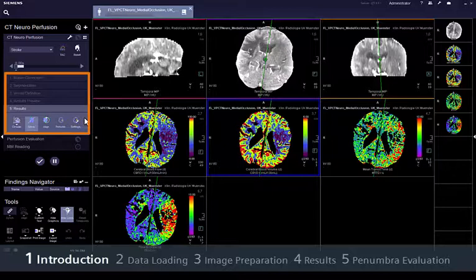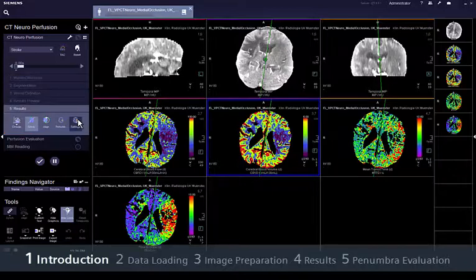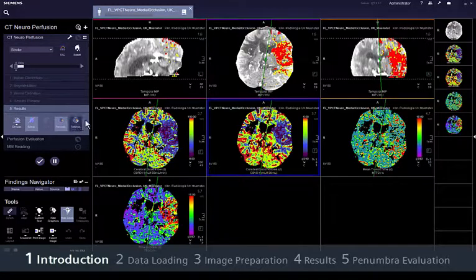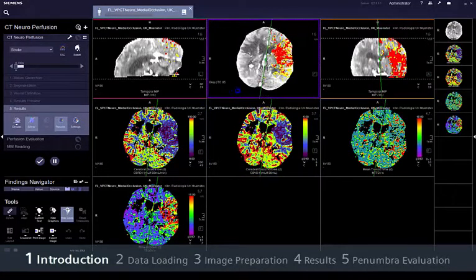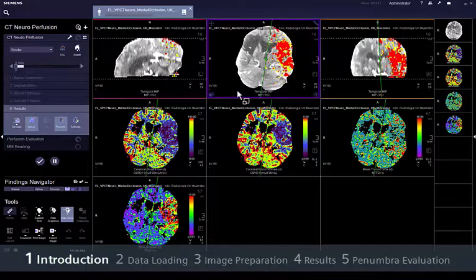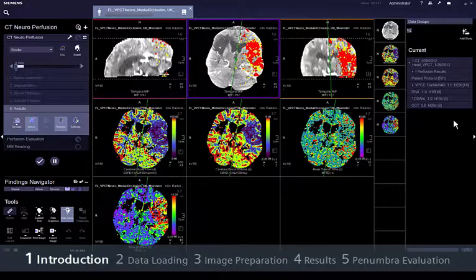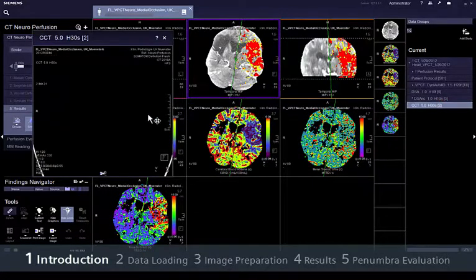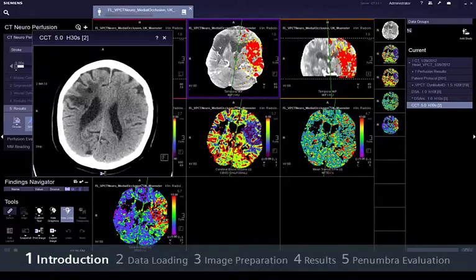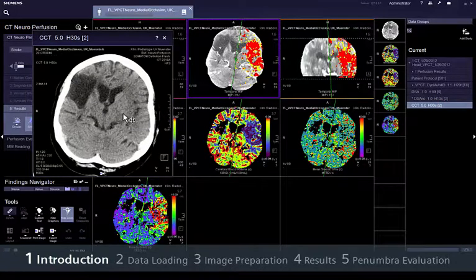It takes just 5 simple steps to view the core infarct and penumbra. Tissue at risk can easily be visualised in 3D colour maps based on the mismatch between blood volume and flow, or any other combination parameters.